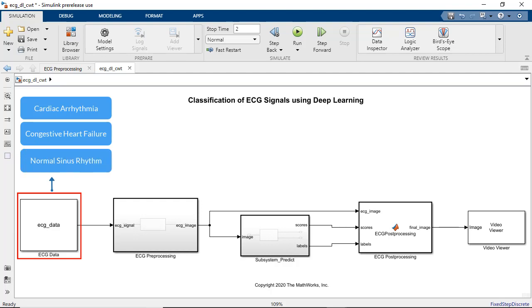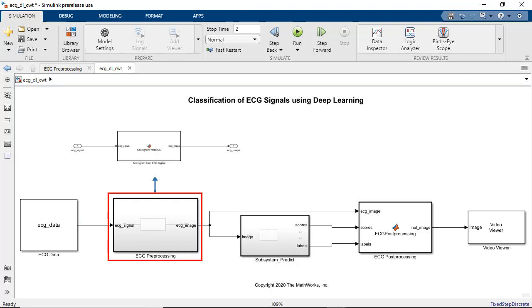and normal sinus rhythm. The ECG preprocessing subsystem performs continuous wavelet transform on the input data and outputs images in the time frequency representation.